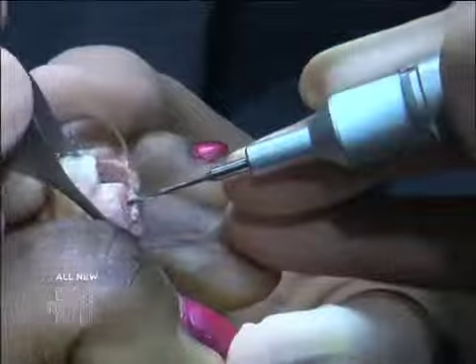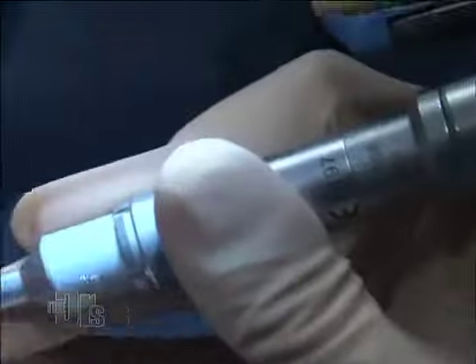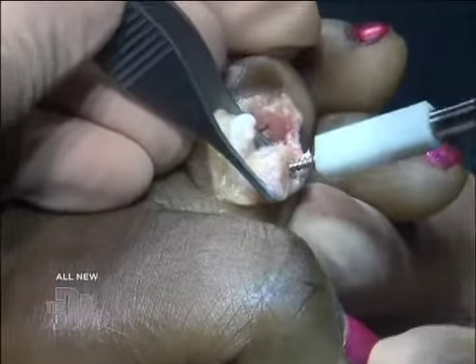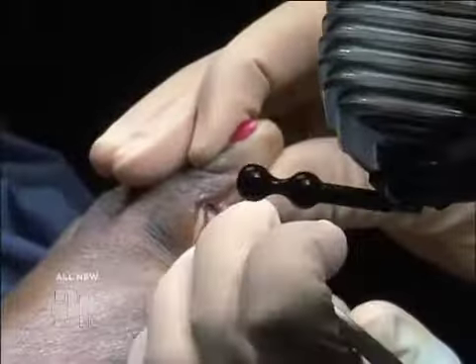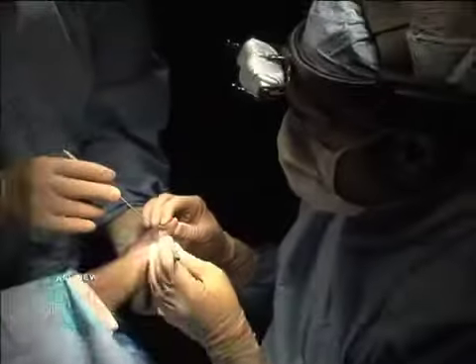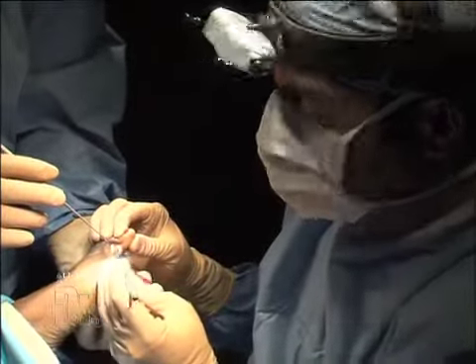We're going to drill a small hole. This sits inside of her toe, holding those two bones together. And we just carefully and precisely thread it in. And then what we do is we place the little cut that we did over the blades, and we slowly push it on. So what you see here is perfect juxtaposition of the two bones, which is basically a perfect fusion. Look at how perfect the length of that toe is.